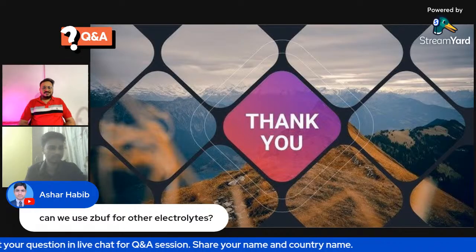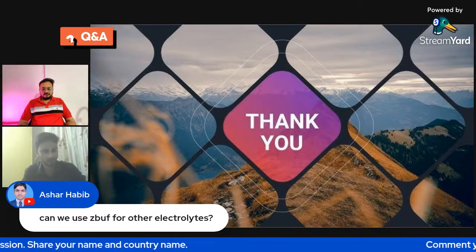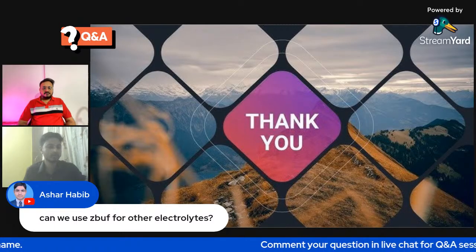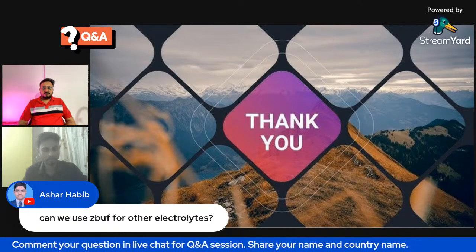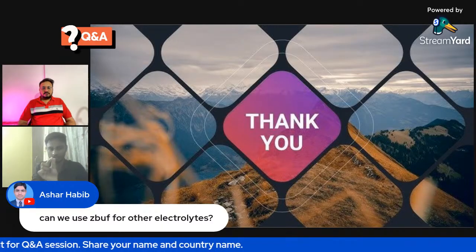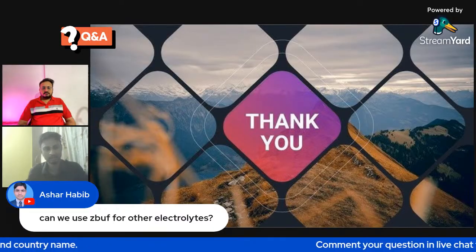One more thing, one person is asking about the centrifugal pump. We are using ultrafiltration on the ECMO side also, sir. But in ECMO with a centrifugal pump, the resistance is more. The ultrafiltration tubing size is very small, so it won't be effective.